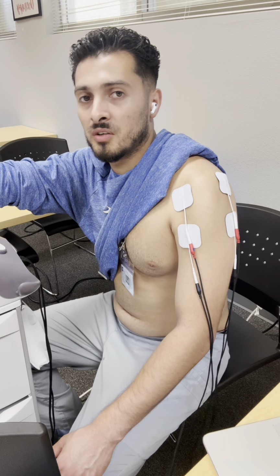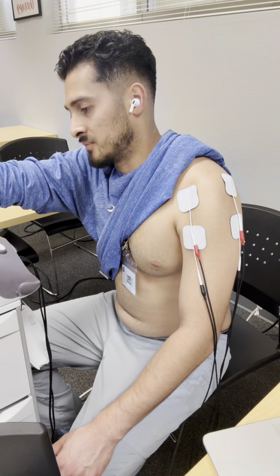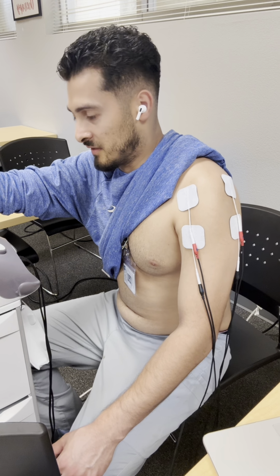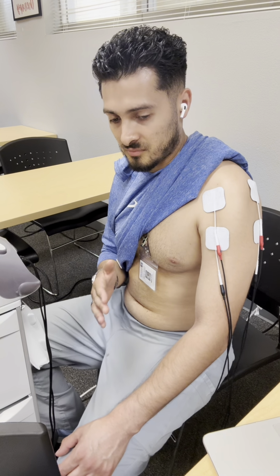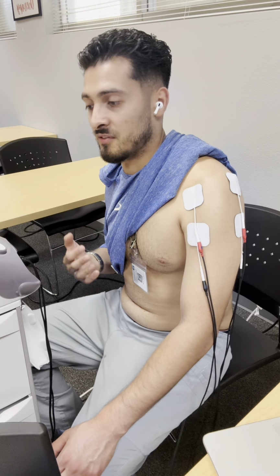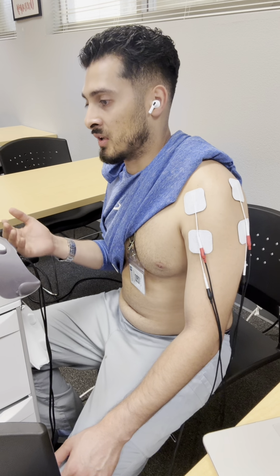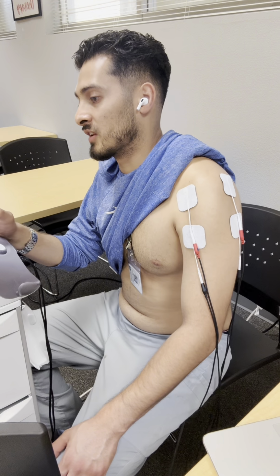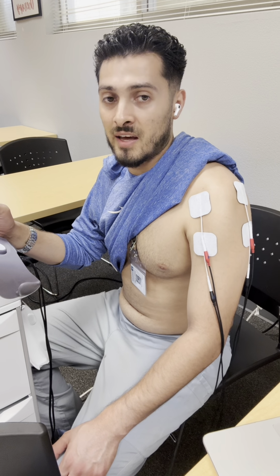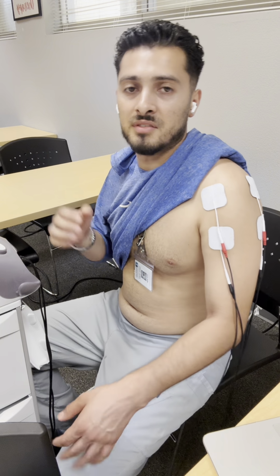Yeah, just explaining to your patient what all these sensations are gonna feel like, and then having that even distribution of patient comfortability versus what you're trying to achieve with this. So if it's pain control, it's not gonna help them with the pain if it's painful during the process. But you do want to make sure you have just enough power with the velocity so that it can achieve that opioid effect. But yeah, that is the IFC machine there for you.